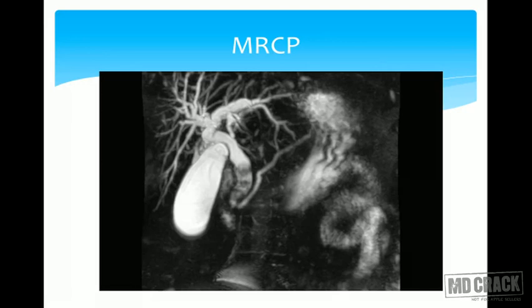Again, MRCP, that is the magnetic resonance cholangiopancreatogram. It's a non-invasive method. It shows excellent details about the pancreatic duct, the CBD, the gallbladder, and the intrahepatic biliary radicals. If there are any anatomical variants, you will be able to pick those up.